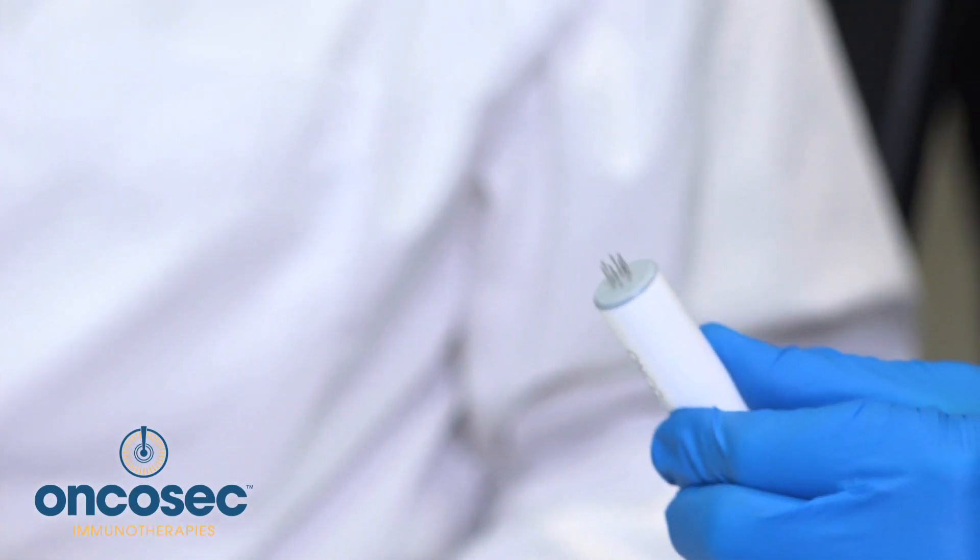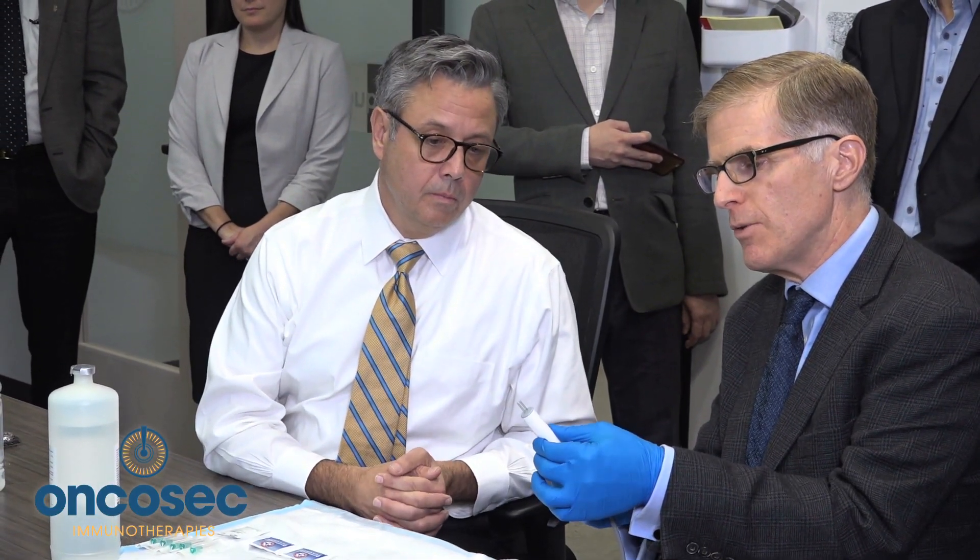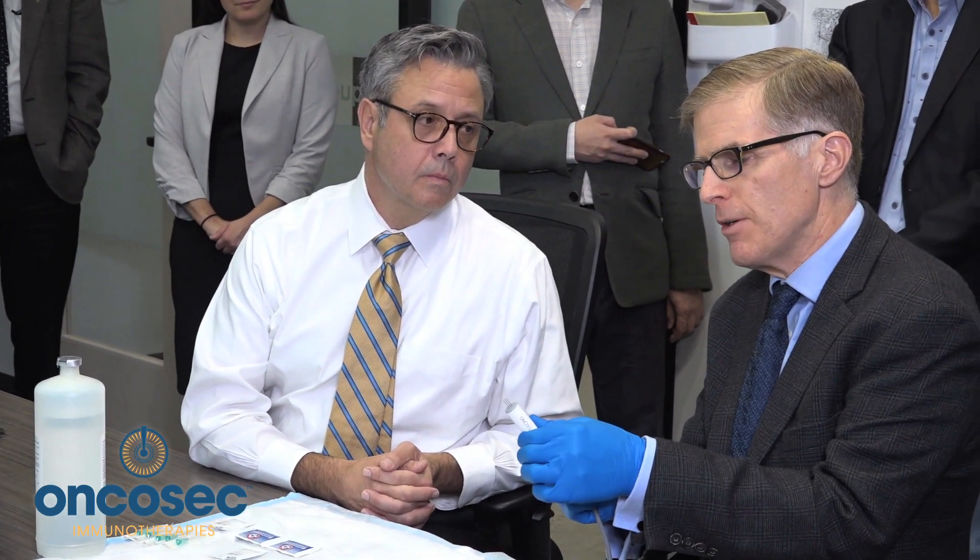You then use this electroporation device, which is an array of six electrodes. They extend like this — you can adjust how far they go. If somebody has a tumor that's a little deeper to the skin, you extend it further. If somebody has a superficial tumor, you adjust it to be more superficial so you only go as far as you need to.